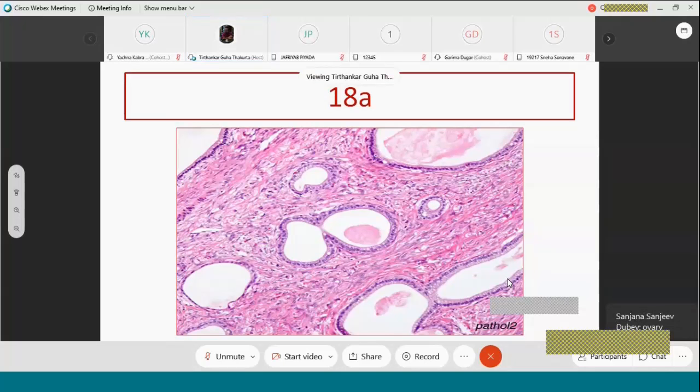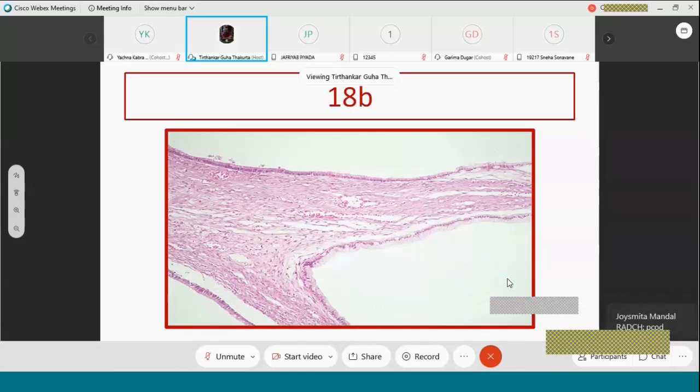Very good. This is the ovarian stroma. That is why I said you have to develop an eye for the ovary. And you can see multiple cystic structures here filled with mucin. So there are pink mucinous substances in the glands. That means that it is developing into a kind of tumor, a glandular tumor that contains mucin. This is called mucinous cystadenoma. This diagnosis is called mucinous cystadenoma.